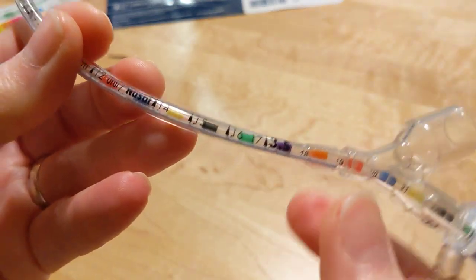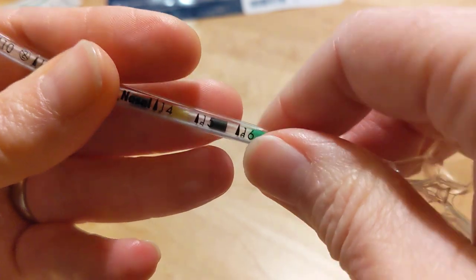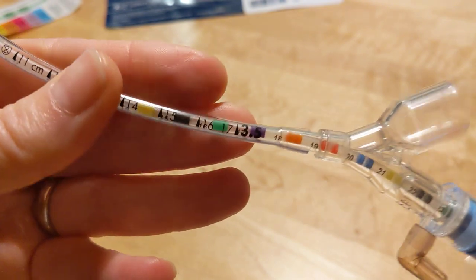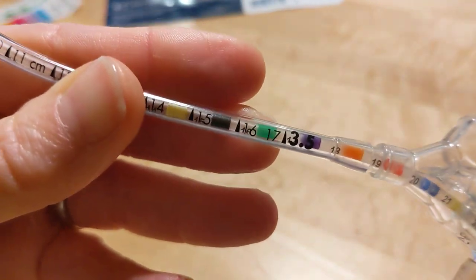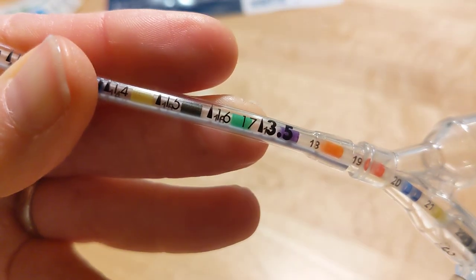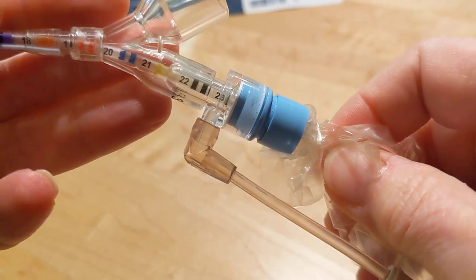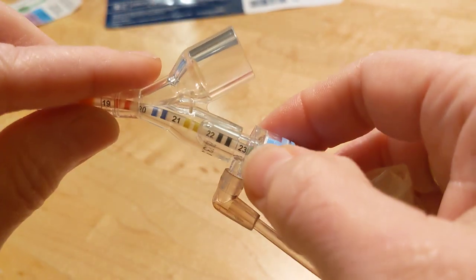You can also look at the numbers on your ET tube and the numbers on the suction catheter — that's the other way you can do it in a pinch. You'll see that the 16 matches up with the 16 on your suction catheter when you're close to your 23, in this window.